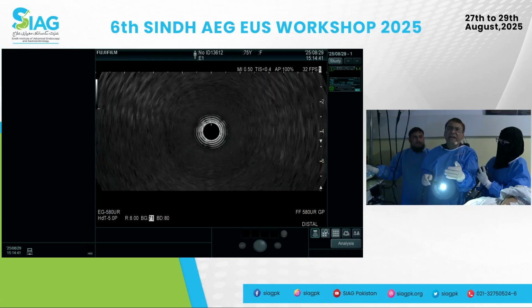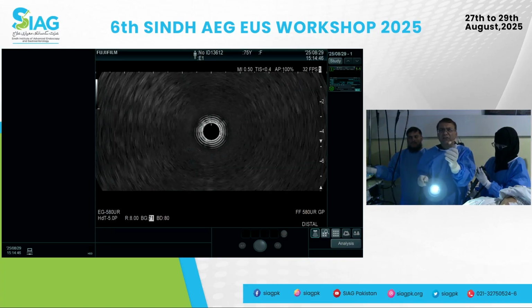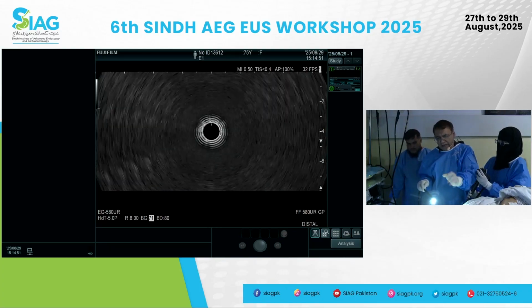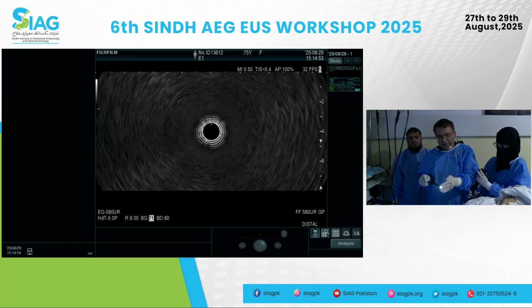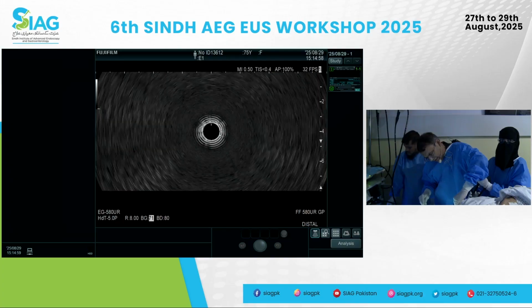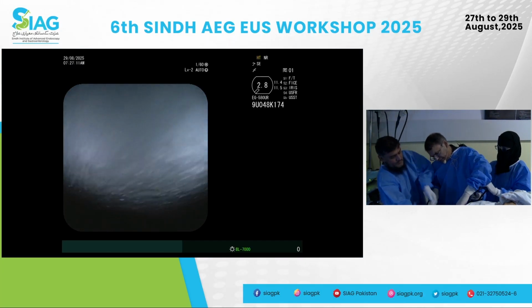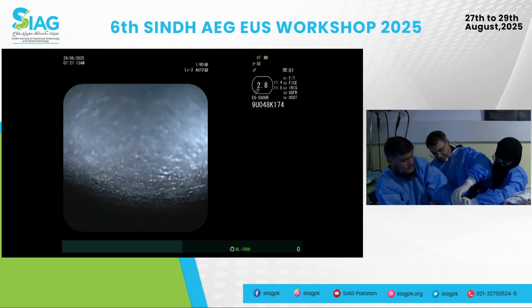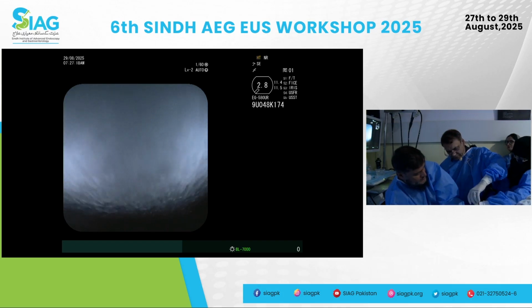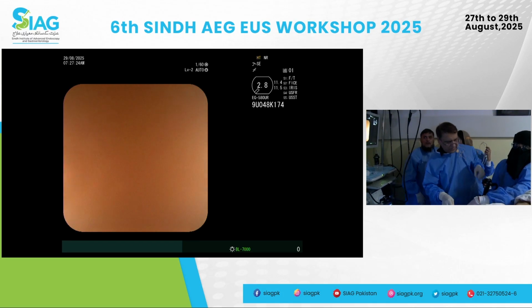The reason I do that is, if people are watching, especially in the conference, just to be more respectful, I usually freeze the endo image, then go into the rectum, and then I will turn on the EUS image. But in this case, there is no freeze button. Is there a help now? Okay.